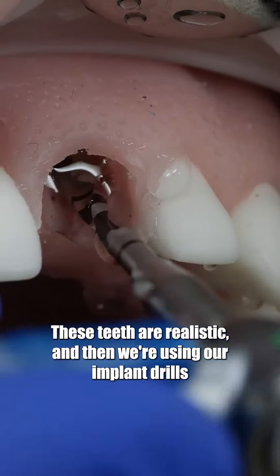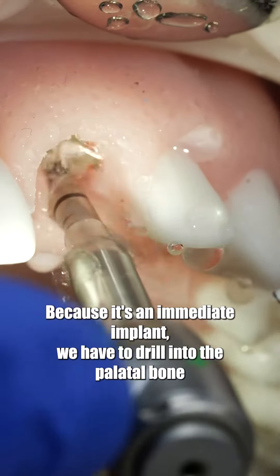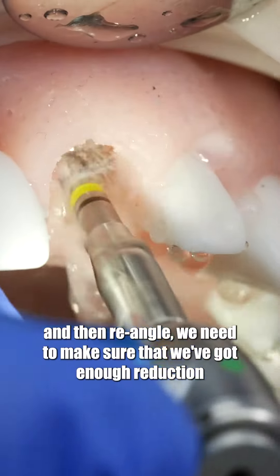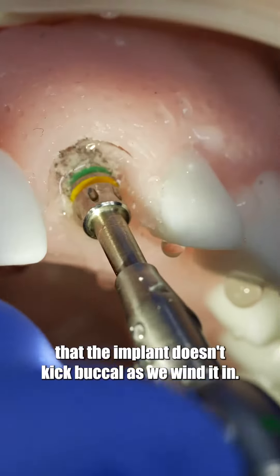These teeth are realistic and we're using our implant drills to create the osteotomy. Because it's an immediate implant, we have to drill into the palatal bone and then re-angle, and we need to make sure we've got enough reduction that the implant doesn't kick buccal as we wind it in.